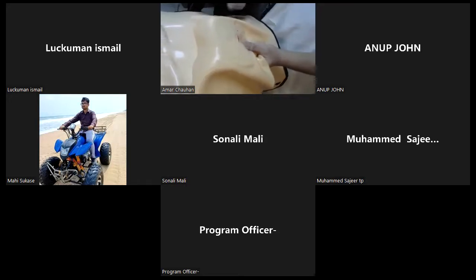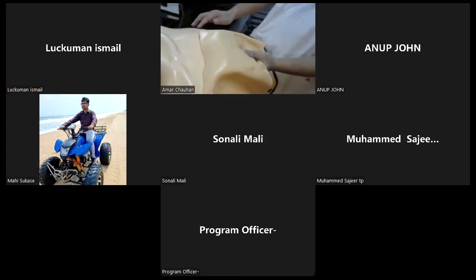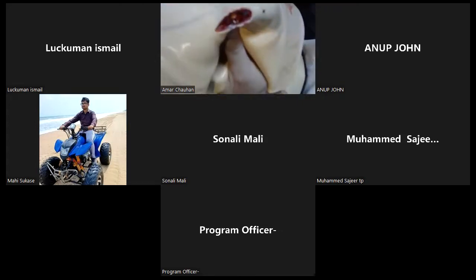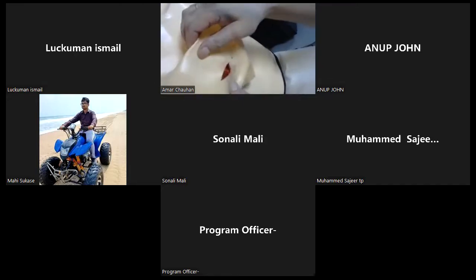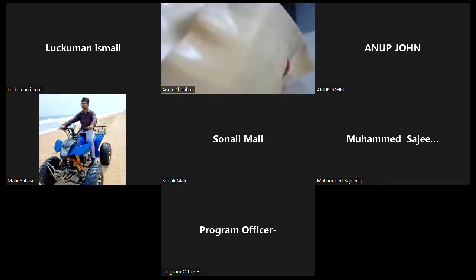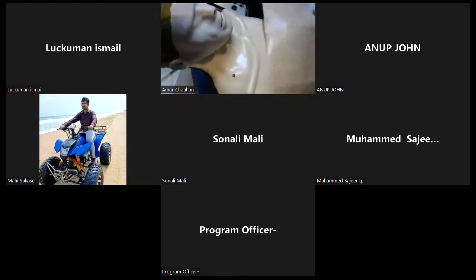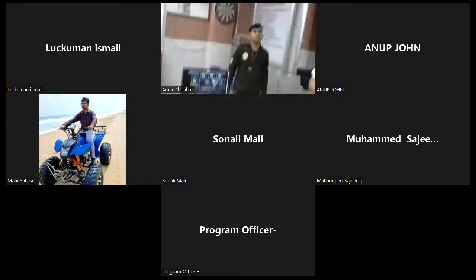No. The mannequin is not breathing. Okay. Skin incision, which we mentioned here, muscle dissection, blood simulation after skin incision. Okay. And you have to push your finger inside it. Muscle dissection. This is the incision, like you can see the gap. So you can give 1, 2, 3, 4, 5, 6 incisions. So one chest belt, I'm saying, can be used for 6 candidates.